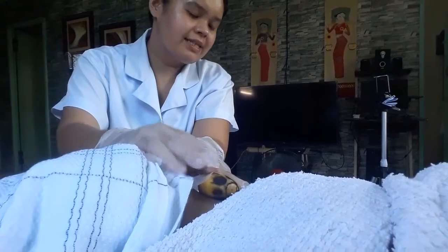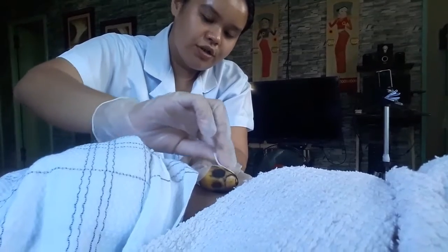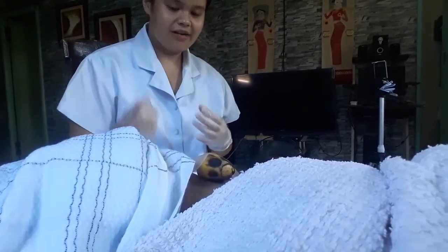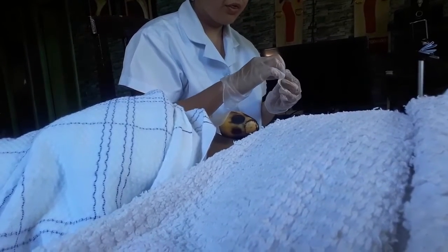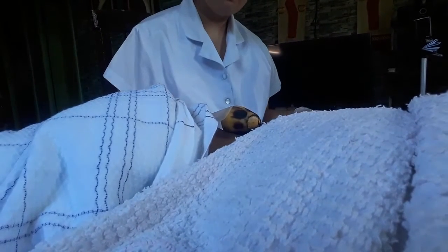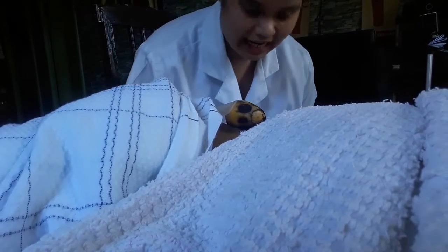And after that, disinfect the area in a circular motion, inward to outward, and let it dry. Do not blow on it. Let it air dry. So now we have another clean gauze pad. The use of this is to put it between our third and fourth finger, because in case the patient might bleed, we can put it directly on the site after injecting the client.